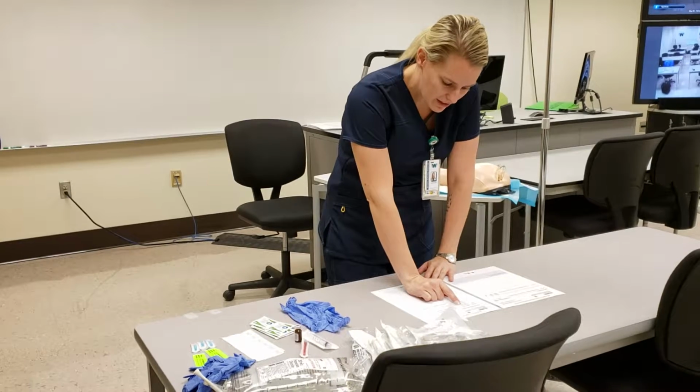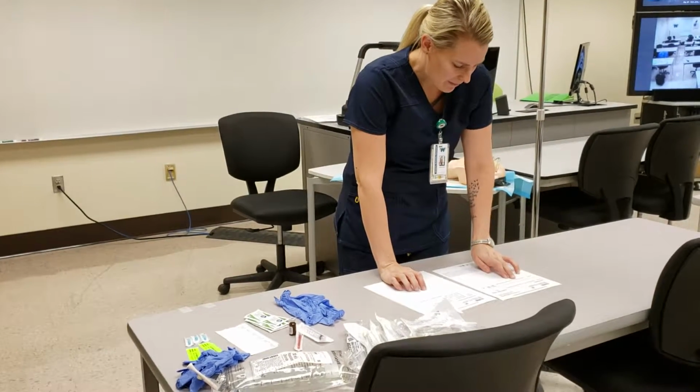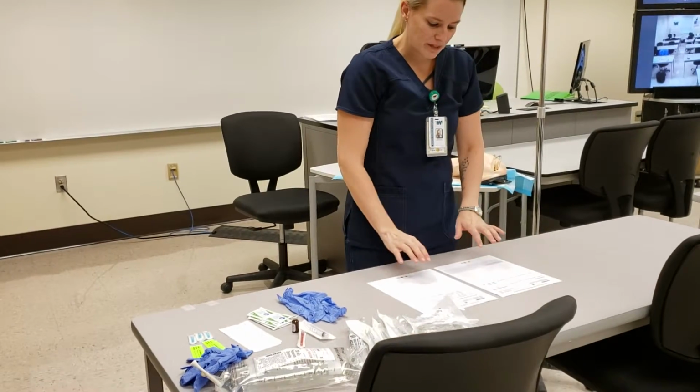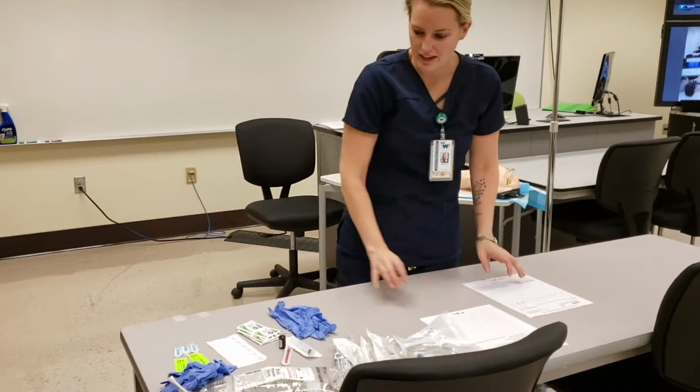And then I have morphine sulfate 5 milligrams IV push every 2 hours. Morphine sulfate 5 milligrams IV push every 2 hours. So the provider's orders do match my MAR, so I'm going to go ahead and get my medications ready.